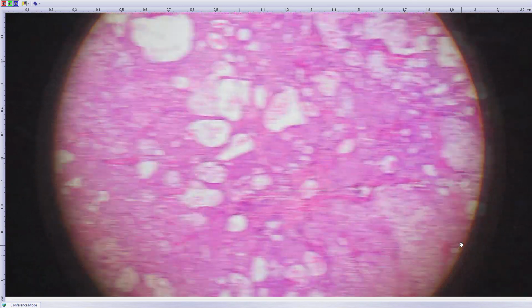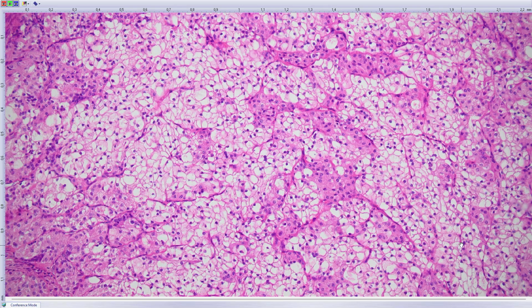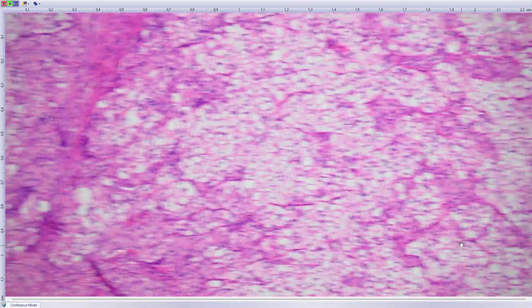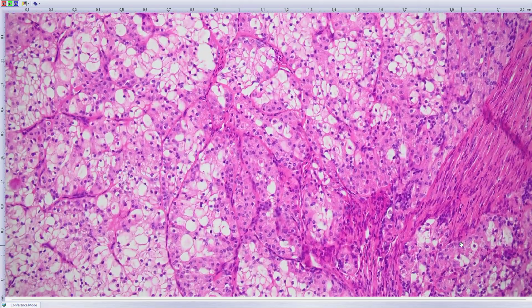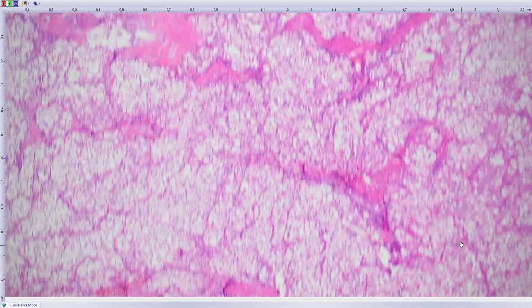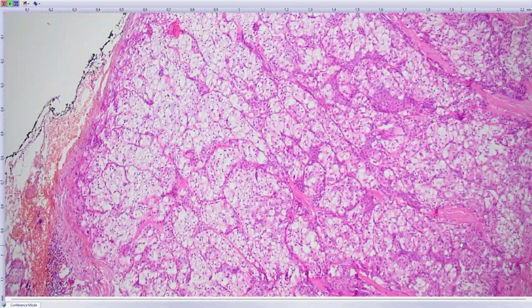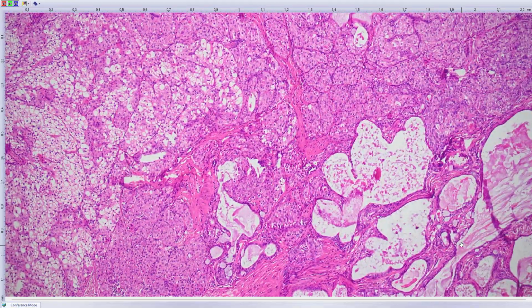Looking just at the places composed of clear cells, that's a typical finding. You see cells with clear cytoplasm, but also cells with eosinophilic cytoplasm. So this area is confusing, let's say, but we also have other areas in this tumor, and this is what we need for a correct diagnosis, with more glandular structures seen here, for example.